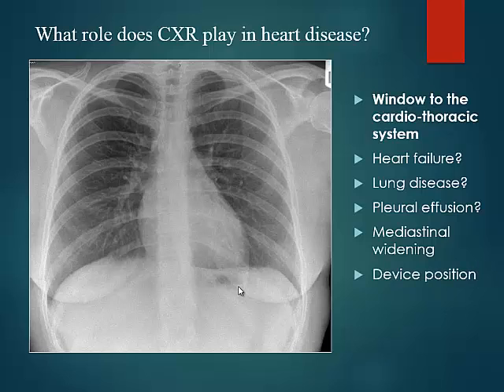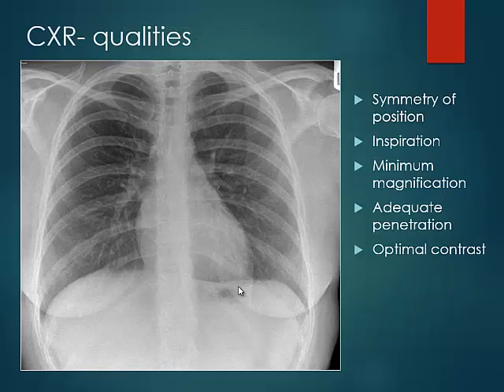Position of the device, which is important, and its complication. And bony abnormalities. Certain bony abnormalities can reflect on presence or absence of certain cardiac conditions. Okay, so those are the main indications.